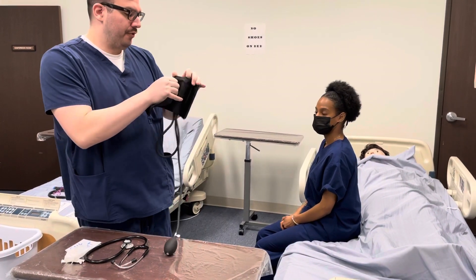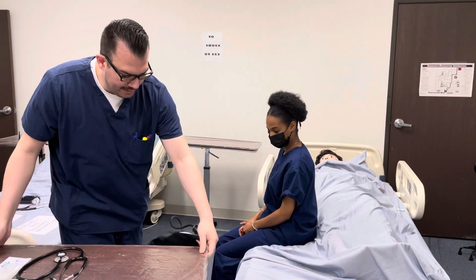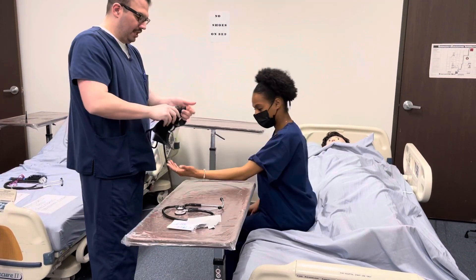Next, I will apply the blood pressure cuff, making sure that the patient's arm is at heart level and that her palm is facing up. Can you please place your arm here? Thank you so much.